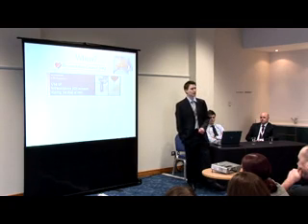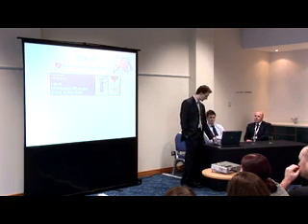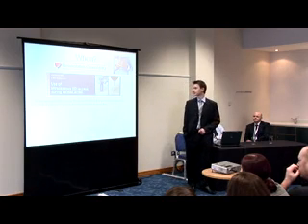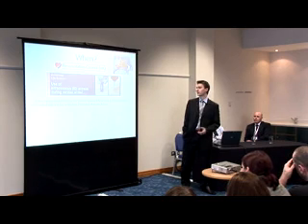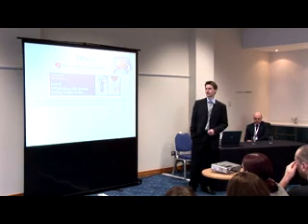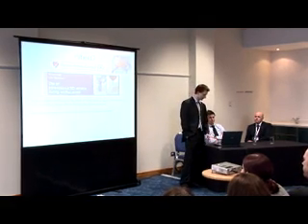Who advocates using them? Well, the Advanced Life Support Group advocate using them, and they came out with this guideline in 2010. So IO access is becoming established as a route of choice: the route of choice if IV access is not possible or associated with a delay in the first 2 minutes of resuscitation. Seems quite quick, doesn't it? That's the Advanced Life Support Group, but it certainly means that it should be something that you should be thinking about doing.